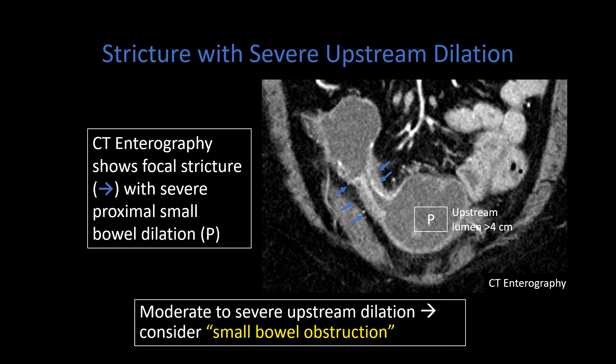Here is another example on CTE of a stricture with active inflammation. We see inner wall hyper-enhancement, wall thickening, mural stratification, luminal narrowing, and then severe upstream dilation. We also see some severe downstream dilation, which likely indicates there's another stricture. In some cases, depending on the patient's symptoms, this could manifest as a small bowel obstruction.